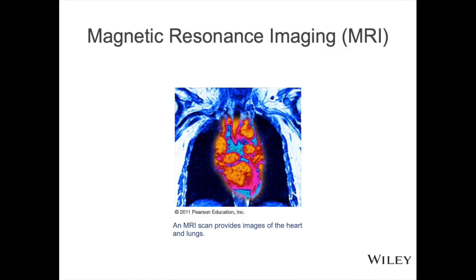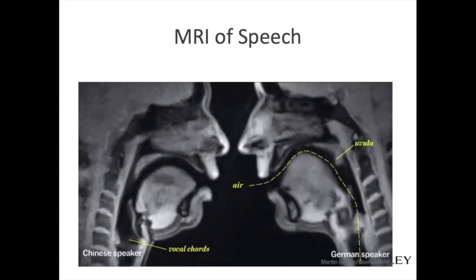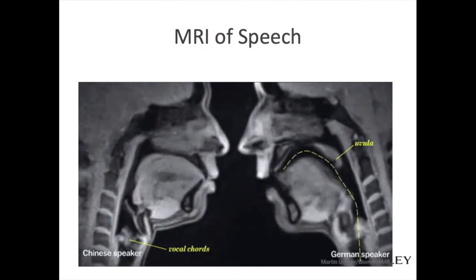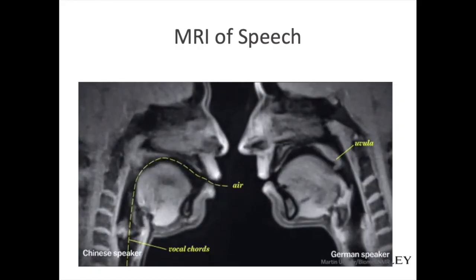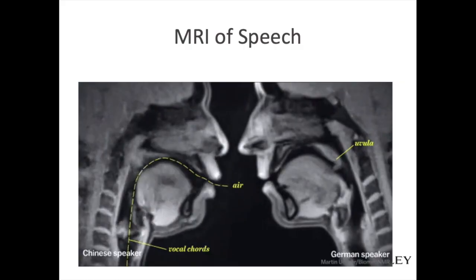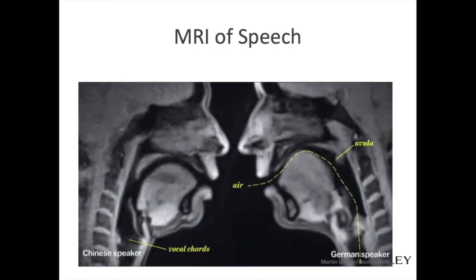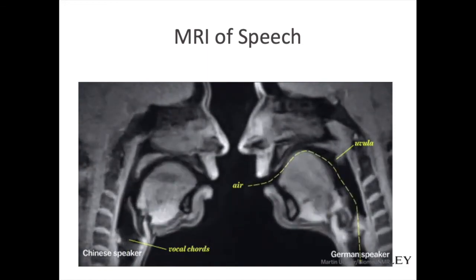Okay. The other image I showed my Chem 103 students is this one, which I think is a really cool picture, where you can get people to perform different movements. In this case, speech. So you have two people talking in different languages, and you can actually see the difference in their speech patterns or the way they form their words. And yeah, that's something you can't really observe with any other medical diagnostic techniques, which I think is kind of neat.